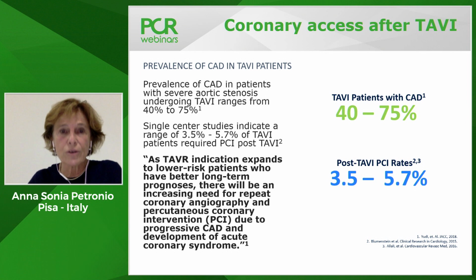But if we are going to treat younger patients, this is something we really have to think about, because they will have 15 or 20 years left after a TAVI, and they need a guarantee on their PCI and access to their coronary arteries.